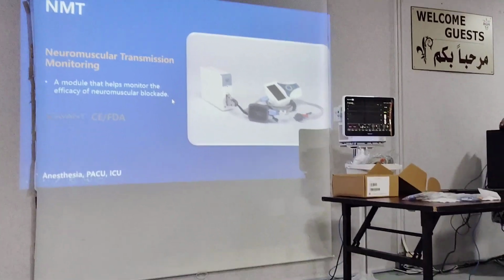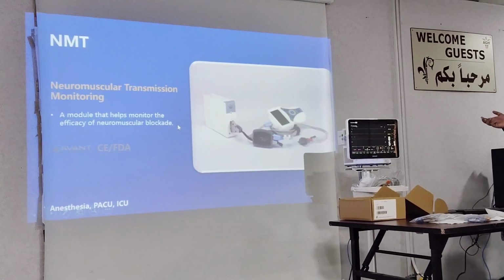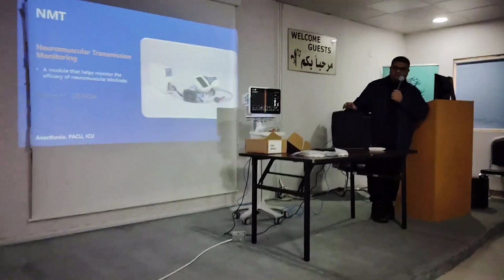What is interesting about this is it has different modes. I think most people might know this as TOF, train of 4, because it sends 4 electrical signals. I will show you.